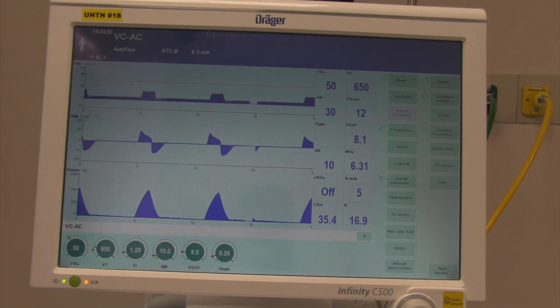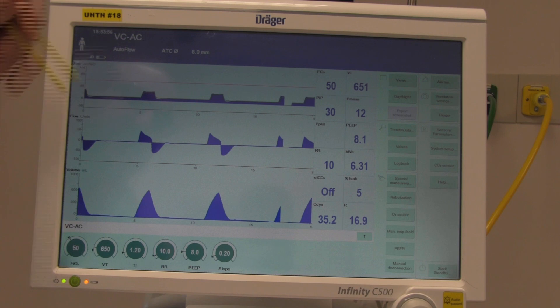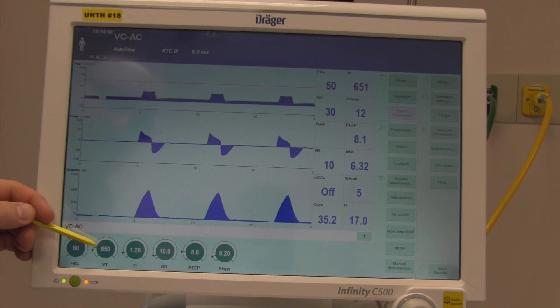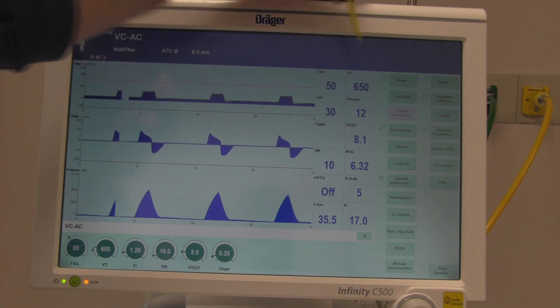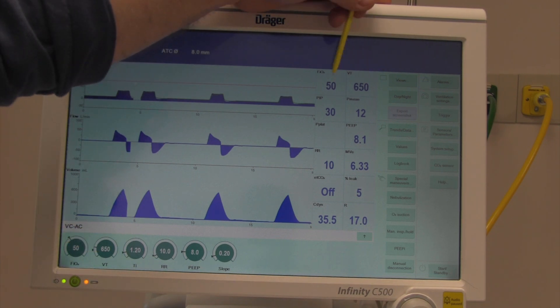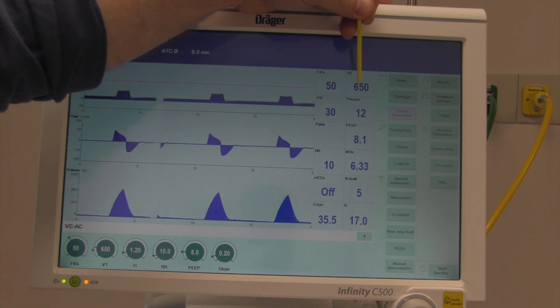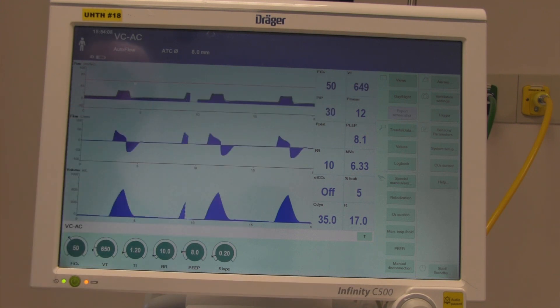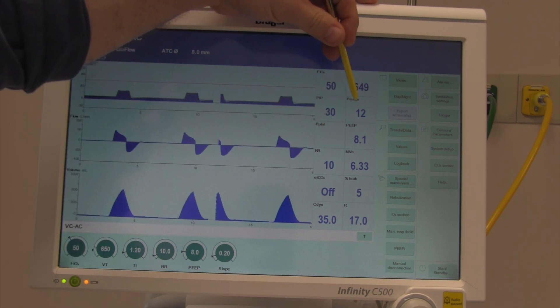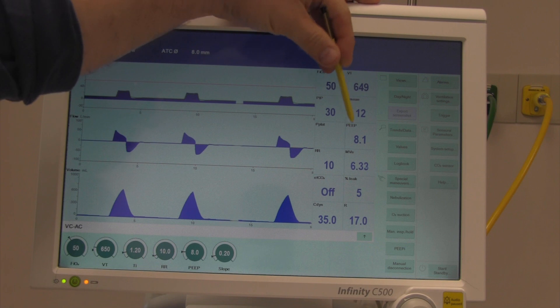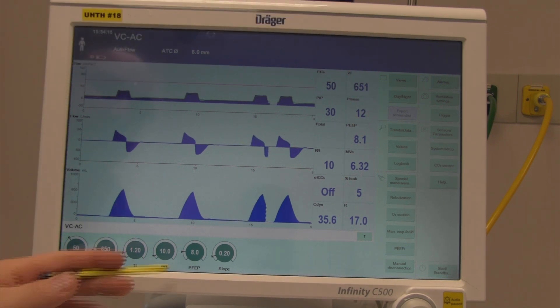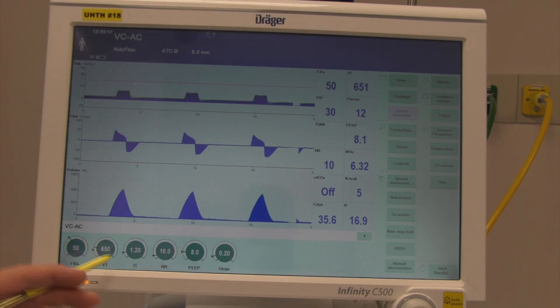FiO2 is set at 50 and reading 50, which is appropriate. Tidal volume is set at 650 and the exhaled — which is more important than inhaled — reads 650. We also have our inspiratory pressure, P mean or average pressure, and our PEEP, which is reading close to 8 as set.